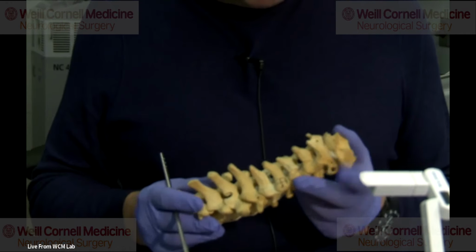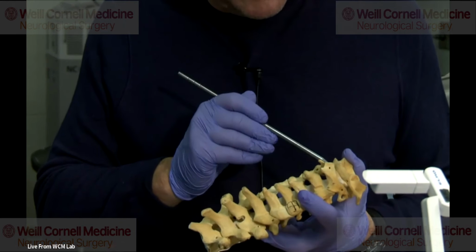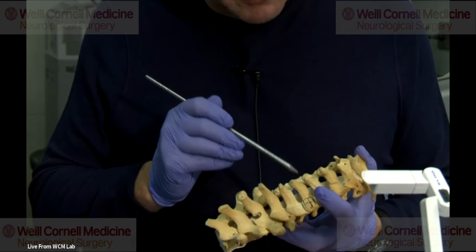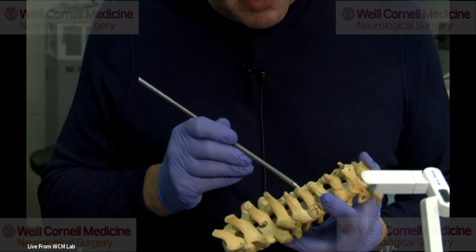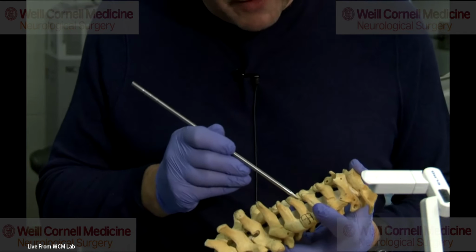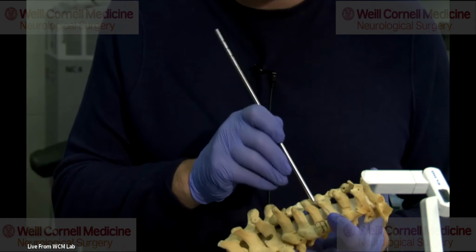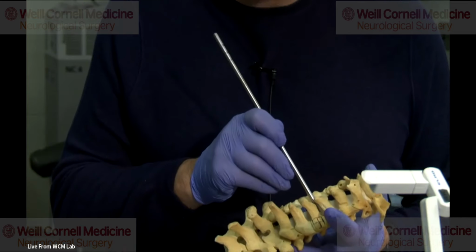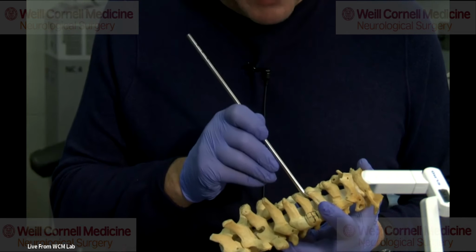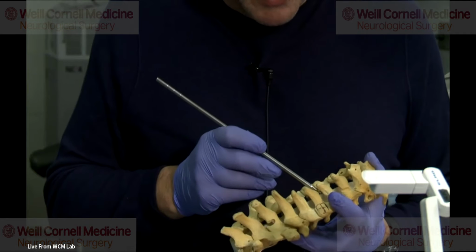So it's all like a beaten up model here, but it doesn't have the skull base, but it has C1, C2, C3, C4, C5. So I'm trying to dock here at the lateral aspect of the lamina, medial aspect of the facet joint. And obviously you have to be careful, because if you push too hard, you can push through the ligamentum flavum here, and you potentially could get a neurological problem here, an injury.